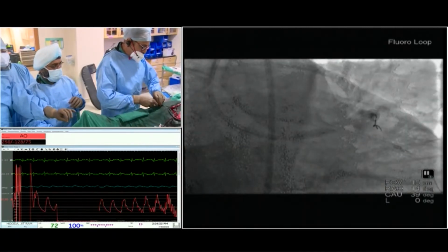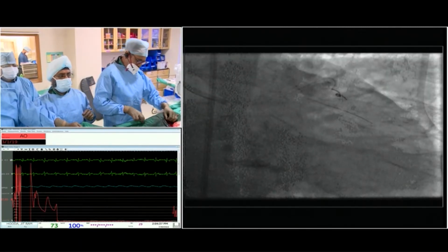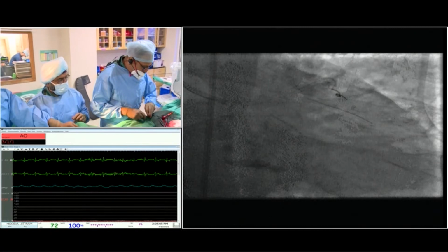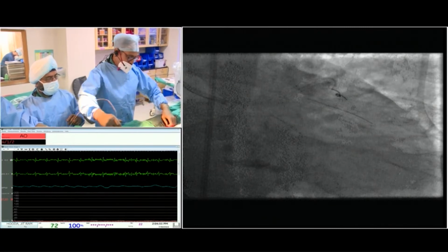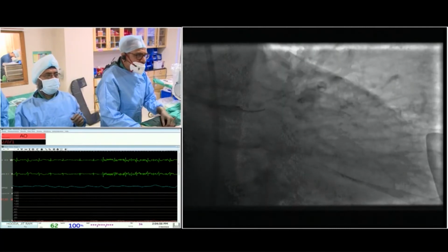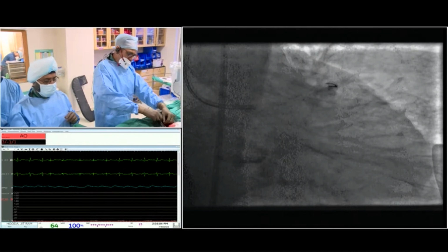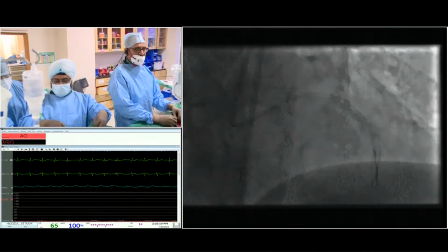So I used the Onyx stent here as per the EBC MAIN, where this was the stent used. There's a new study with an interesting name, the Rolex study, not the Rolex watch, but Rolex, for left main, also with Onyx. They said this bigger size Onyx can expand well to 5.2, and they showed about a 450 patient study and results were quite good. But at the end there is still follow-up, and about 2% event rates, which is still high. In today's case we should be doing this carefully with IVUS guidance.